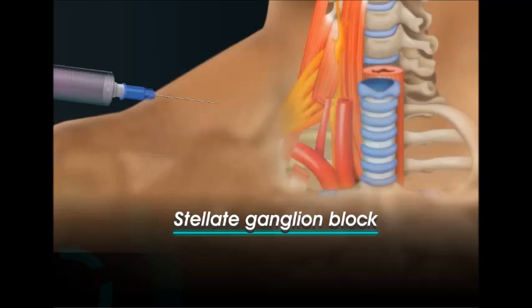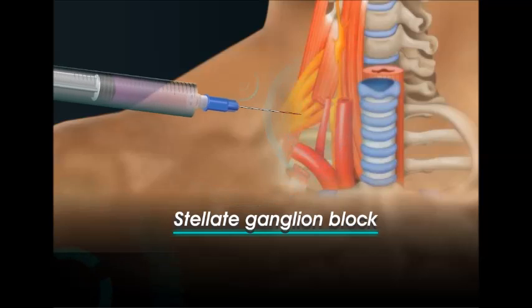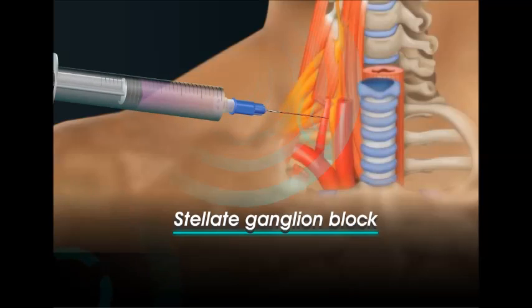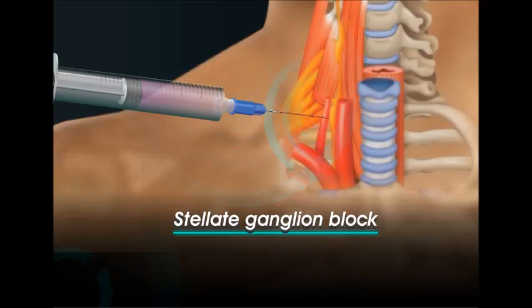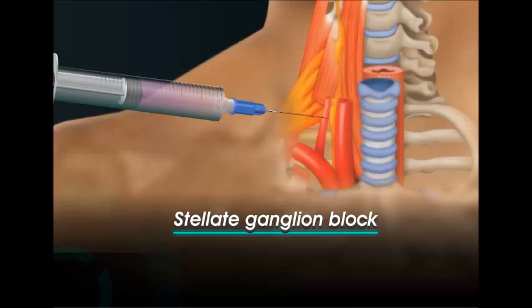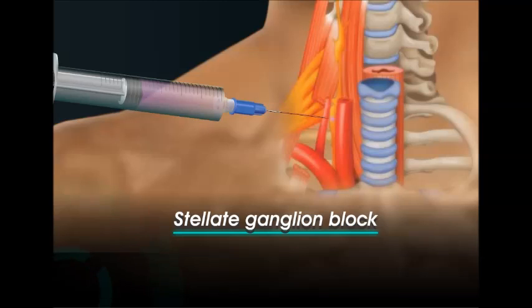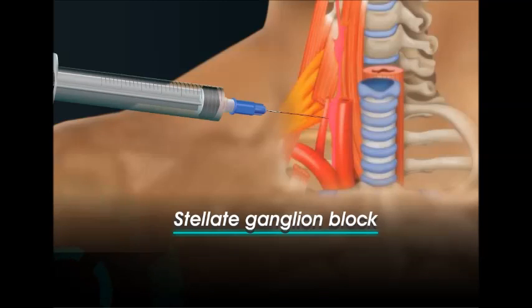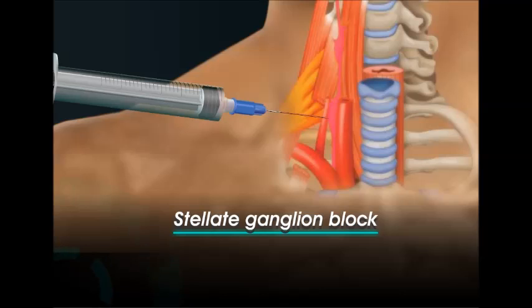He will then use an ultrasound machine to guide the needle close to the Stellate Ganglion. He will finally inject a small amount of local anaesthetic around the nerves.